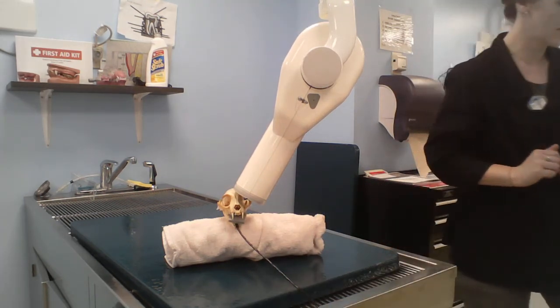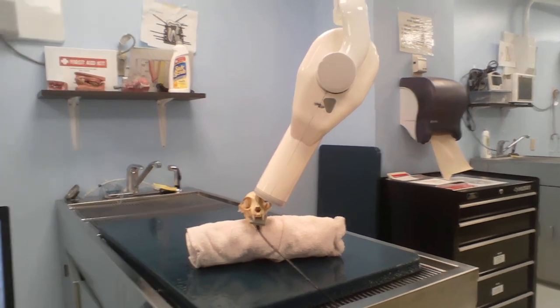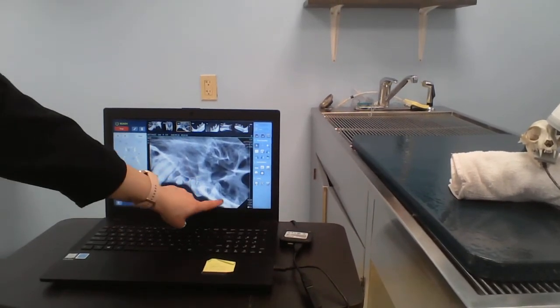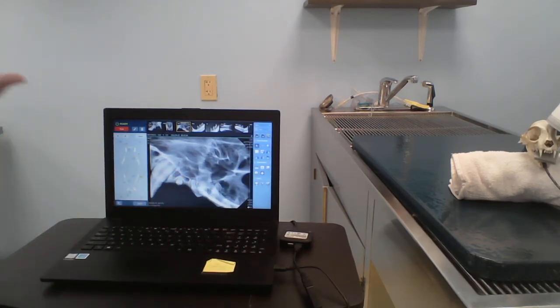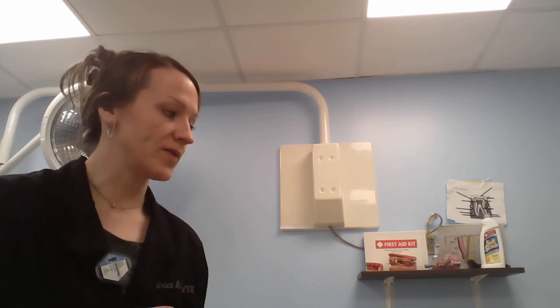Then we're going to step back, expose, and then look for our image on the computer. So now we have the same thing on the other side. The zygomatic arch is right here, kind of in the way a little bit, but we can still see the outlines of the teeth. These are pretty much the general x-rays for the cat of the upper jaw, or the maxilla. I will do another session for the bottom mandible, and then I will show you the last view of how you can do the extra oral version of the maxilla to move that arch on the back.